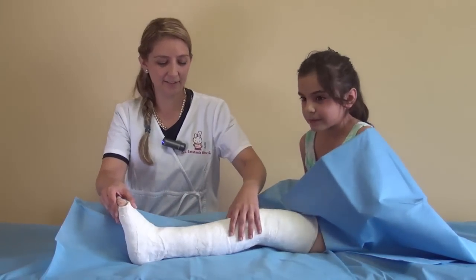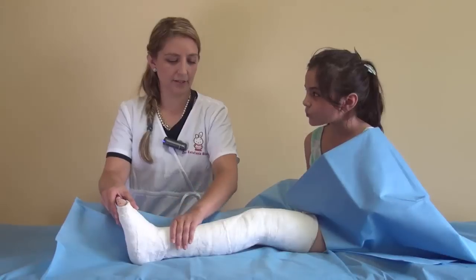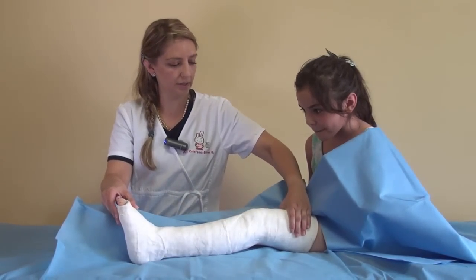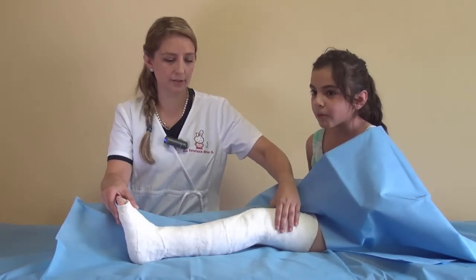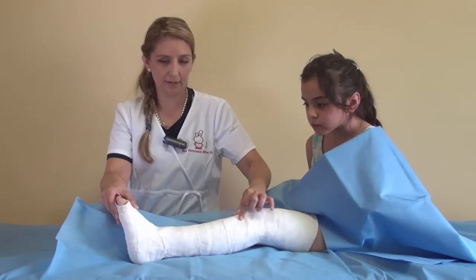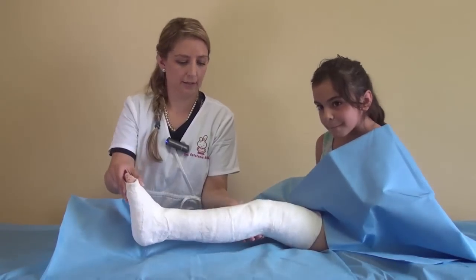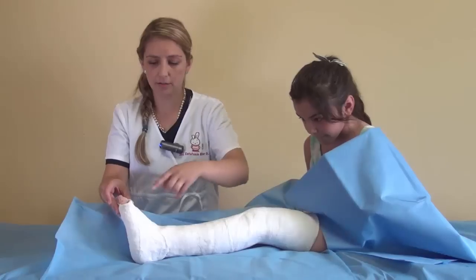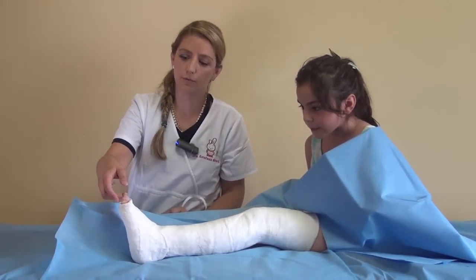This is the final result of a long leg cast, molded in a triangular shape in the leg and a square shape in the thigh. Also with a molded zone in the supracondylar zone, protecting the patella and the patellar tendon and the popliteal region, and padded at the ends of the cast with some space to move the toes.